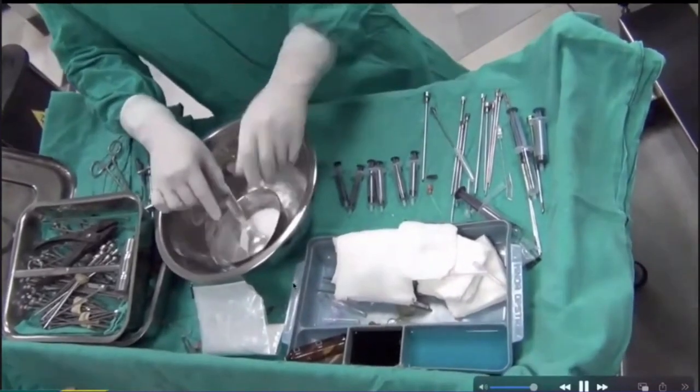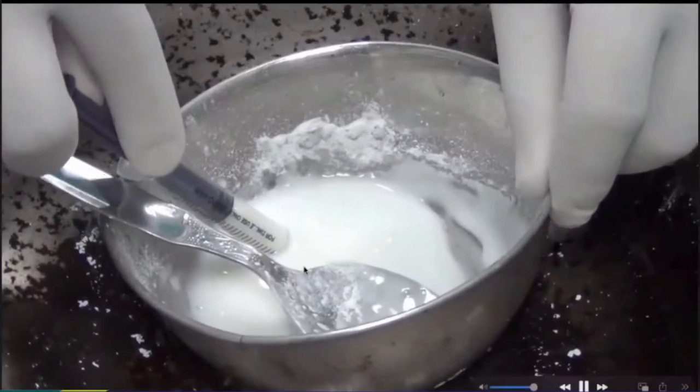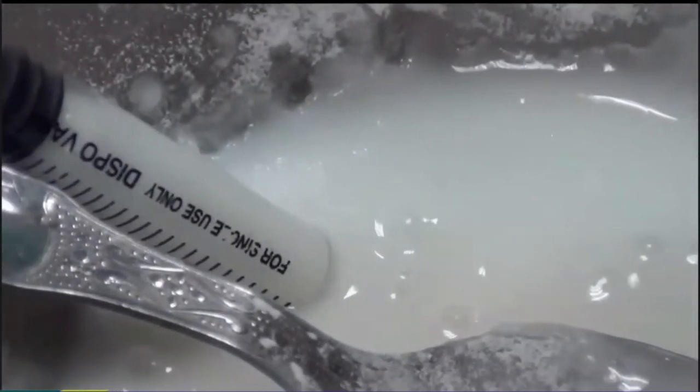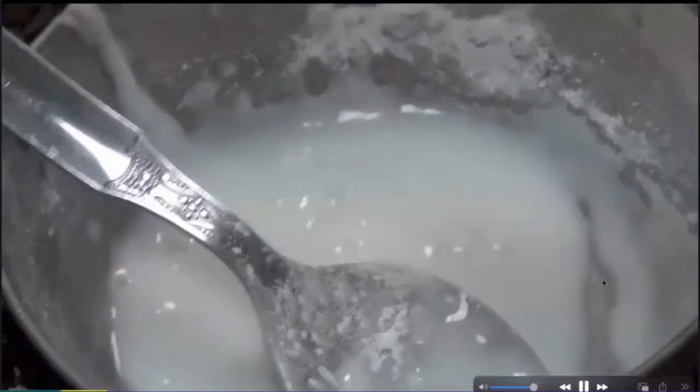And then once the cement is of right consistency, I use 2 ml syringes, I told you. So I load 2 ml. No air. There shouldn't be any drop of air because air is compressible, so it won't allow the cement to be pushed in. And you don't want to push air inside in any case. So that's very important.